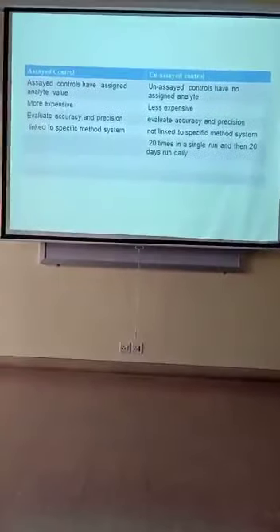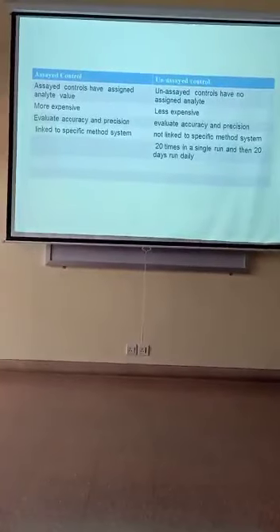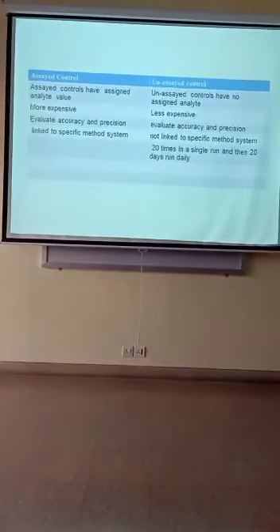Then come the characteristics of assayed controls and unassayed controls. The assayed controls have assigned analyte values.